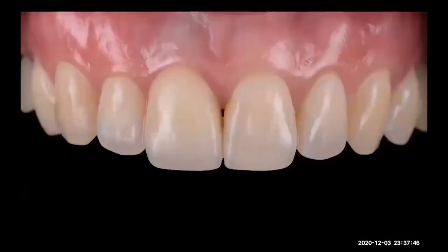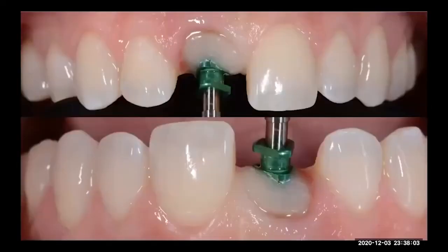And you see, the gum level is a little bit high, but you can see if you pick the right ingot and use a nice stratification technique, you can get really, really close to the natural teeth. Okay. This is another central.